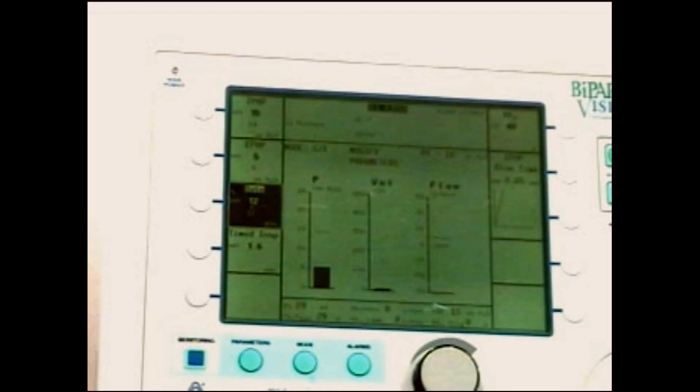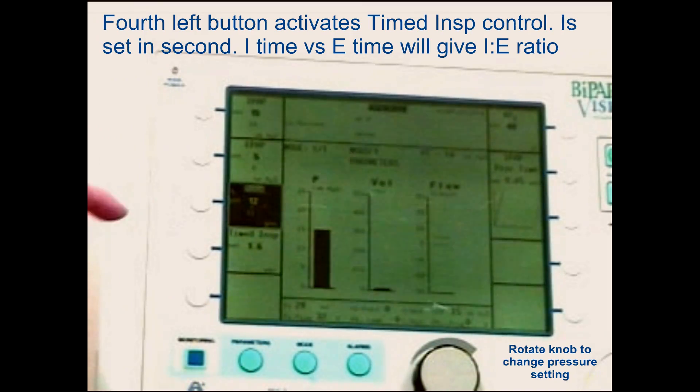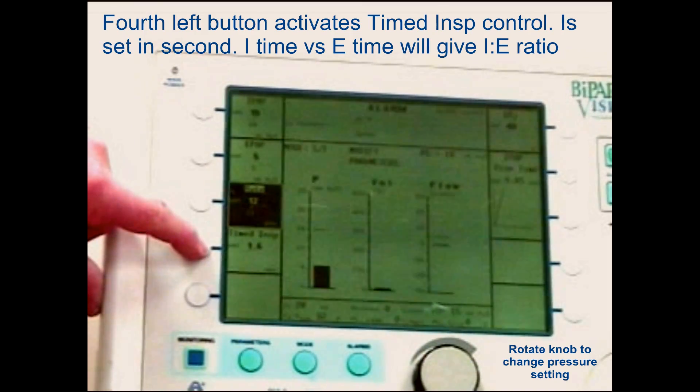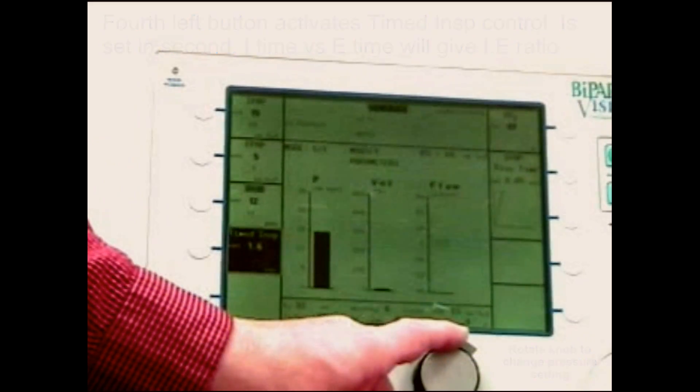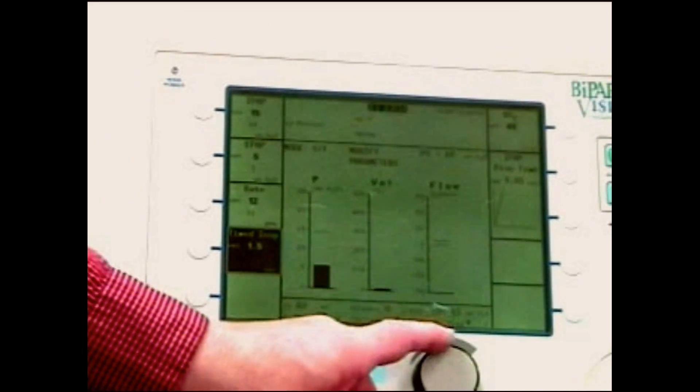Inspiratory time. If you want a 1 to 2 inspiratory time, it's going to be approximately 1.5 or 1.6. We'll go with 1.5 inspiratory time.